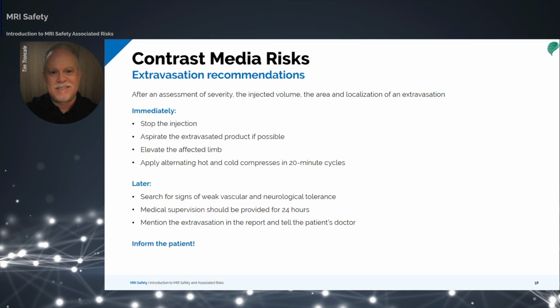Most of these cases will involve a small amount of contrast media, as the contrast injected in MRI is usually no more than 20 milliliters. Because of the small volume, the contrast will reabsorb easily along with any saline that was used for the flush. This is less so with a power injector, because there's typically quite a bit of saline flush in addition to the amount of gadolinium.